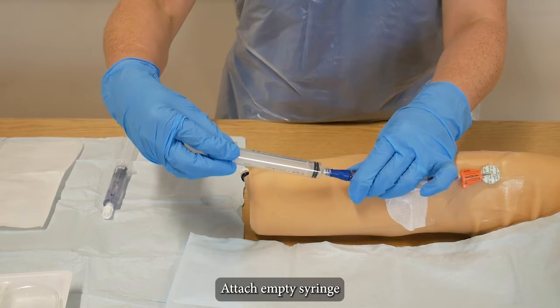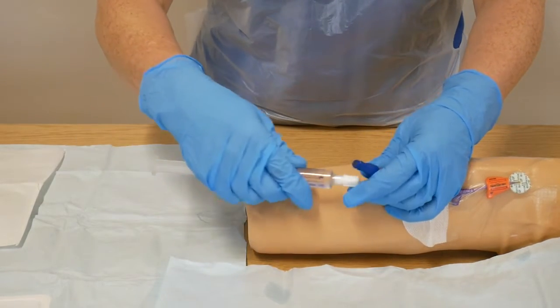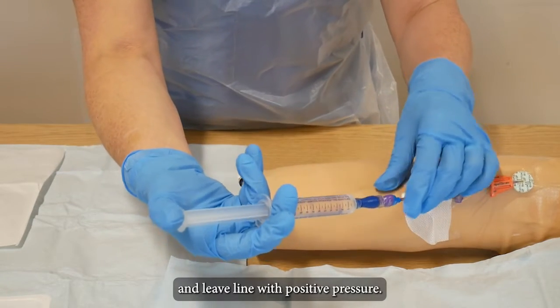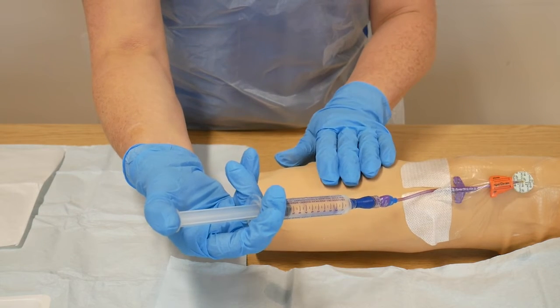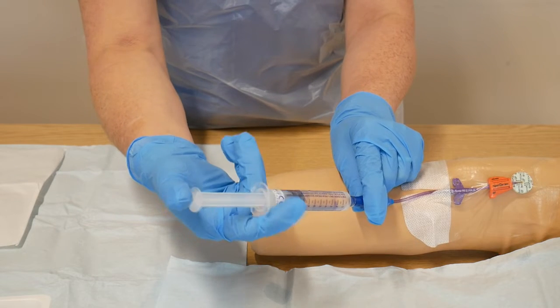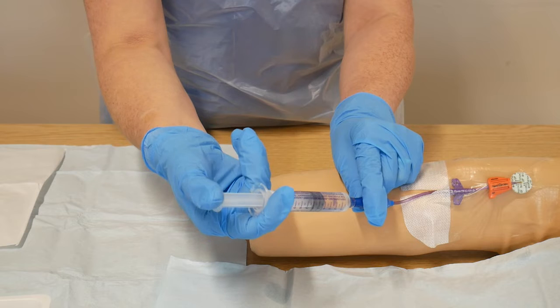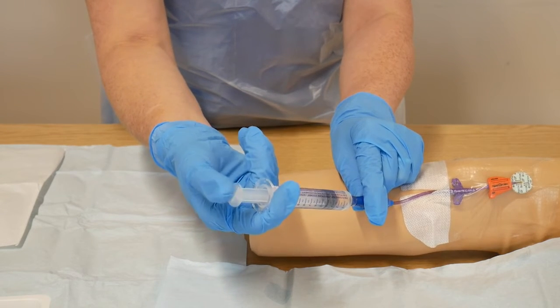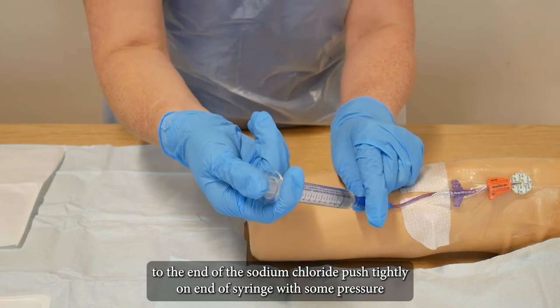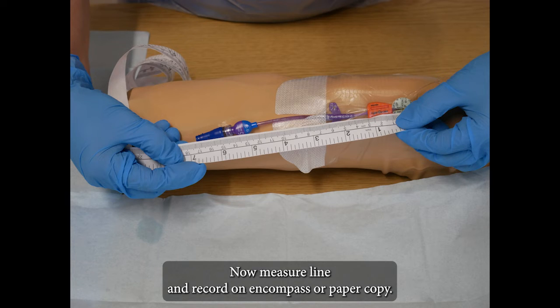Attach empty syringe and withdraw 1–2 mLs of blood and discard. Using a push-pause technique, flush line with 10 mL of NaCl and leave line with positive pressure. As you come to the end of the NaCl, push tightly on end of syringe with thumb pressure and then lock off, leaving the NaCl. Now measure line and record on Encompass or paper copy.